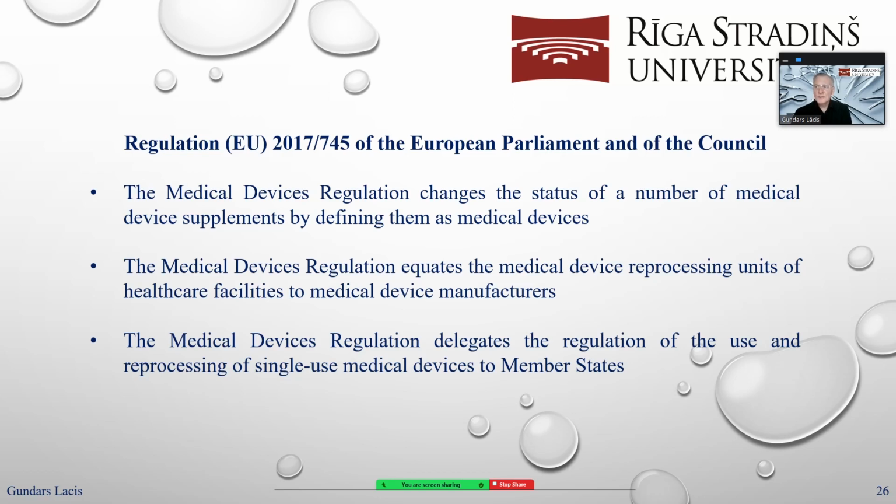Hospitals or hospital CSSDs don't know, because every single instrument is a little bit different. In one surgery, contamination is at one level, in another at another level. And now, starting with this regulation, all hospital CSSDs also are manufacturers, because every time we reprocess a surgical instrument set, we are producing a brand new instrument set. It's a brand new product.